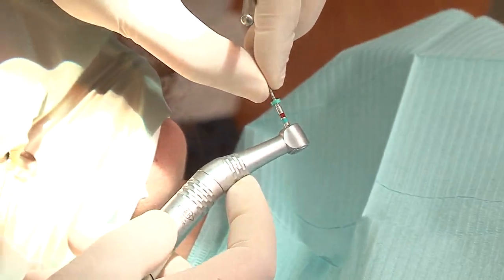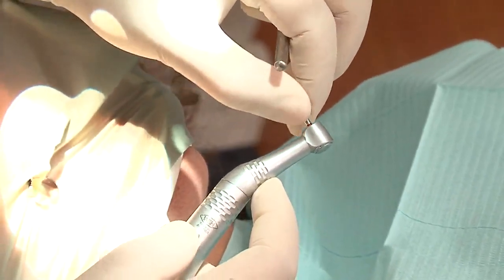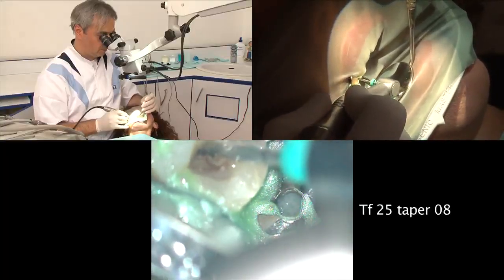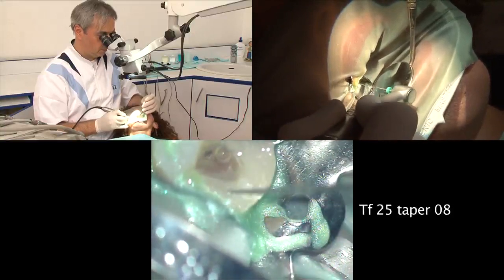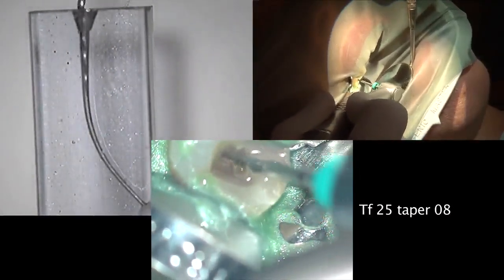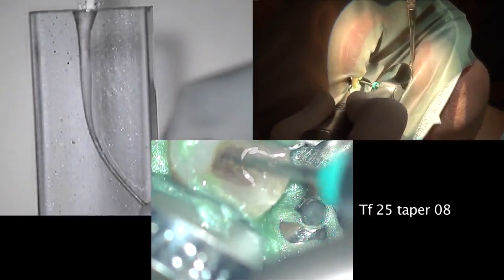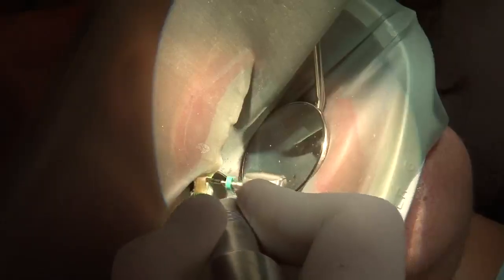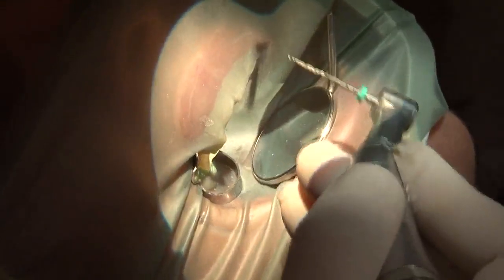We start the crown-down technique using TF files 25 taper 8 and 25 taper 6. This is a 25 taper 08. We never insert the file and lock it inside the root canal, and we never rotate the file outside the root canal. What we need to do is to insert the file until we have a contact, go back one or two millimeters, rotate and do a four stroke movement with 500 to 600 RPMs and our torque level is set to maximum. This is the buccal canal. One, two, three, four strokes, as deep as it goes.